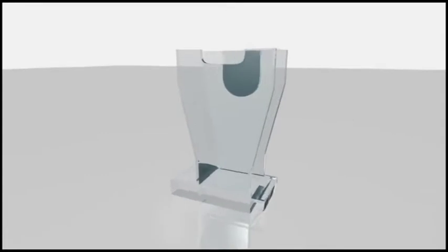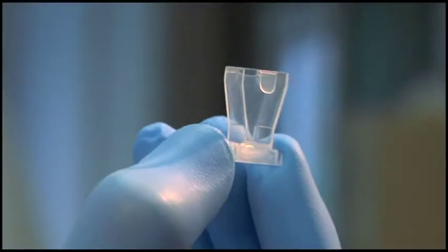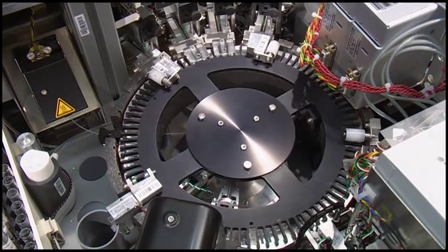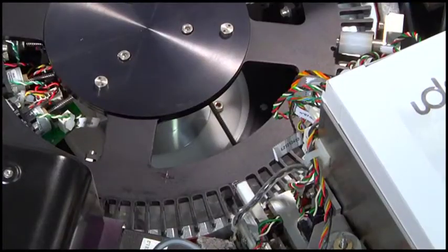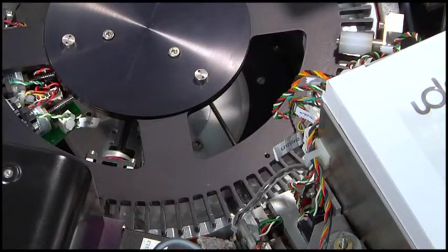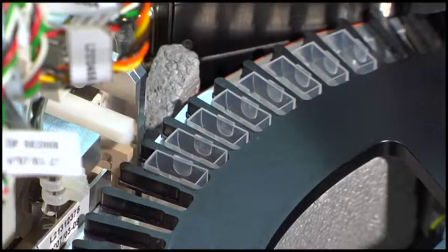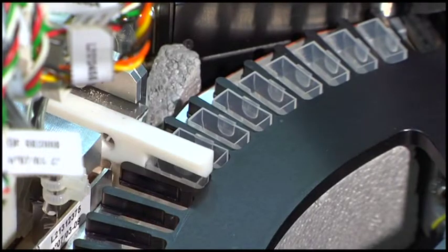Utilizing a single cuvette for each individual test, the IDS Isis processes each assay independently through its 90 position, 37 degrees Celsius carousel. The carousel has access to all the modules and delivers the cuvette to the relevant module at the scheduled time.